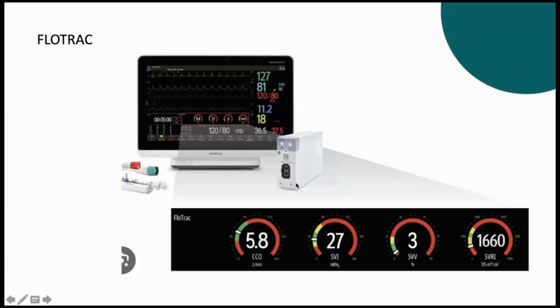So this is a FloTrac module that you have got, and this is the kind of screen that you can get when you use it. So try and use this. We have some transducers with us in the ICU, which you can use. You can connect it here. The prerequisite is you need an arterial line. I think the last time the team would have demonstrated that to you as well. So this monitor is available for us.